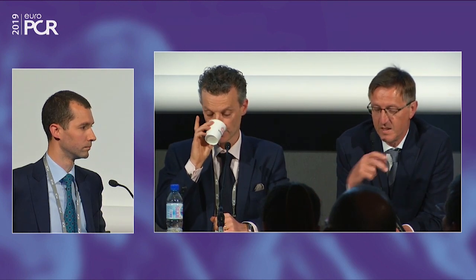You just check if you have done something with the 6 atmosphere after you have gone to 4 atmosphere, just to check if the cracks have been given a modification that will open the balloon. So at the moment you should not go above these recommended pressures. You should be able to generate bubbles in the saline in the balloon, combined with the contrast, to generate the oscillations that should be transmitted to the calcium.